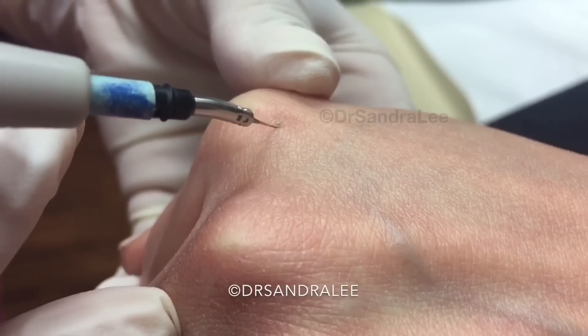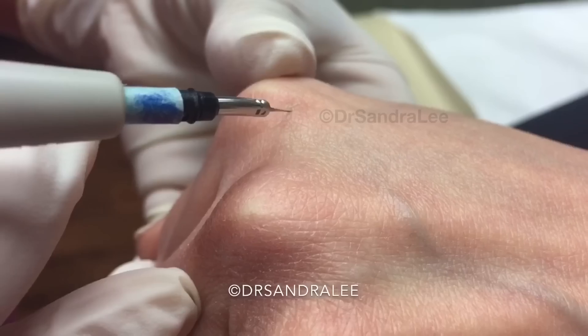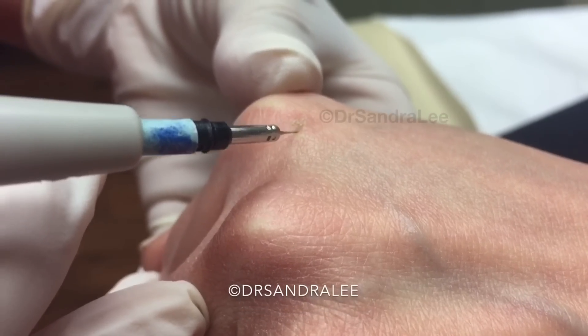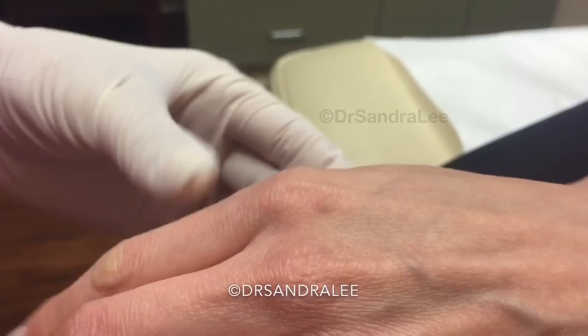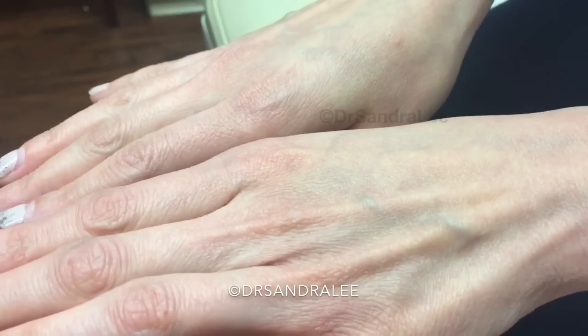I'm going to buzz this one a little more just because it might find its way around it. There we go — a little part will kind of scab up, and hopefully that'll be done with it.